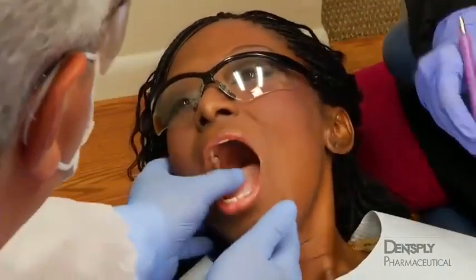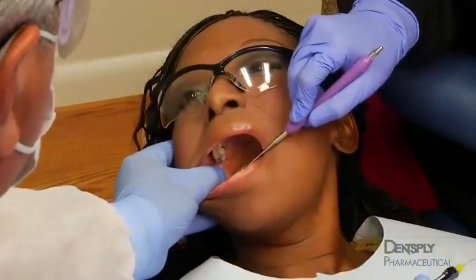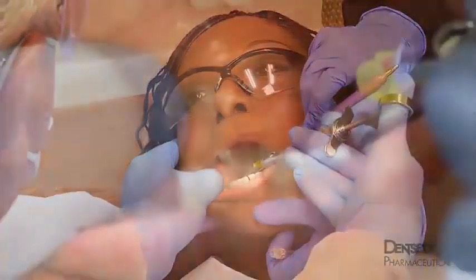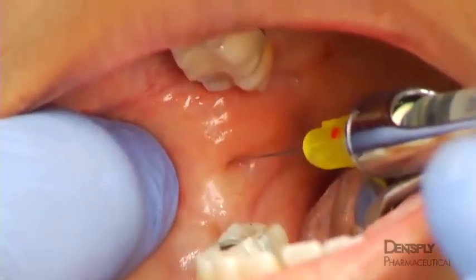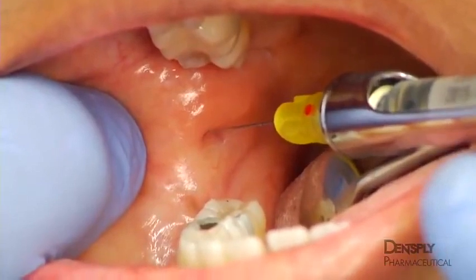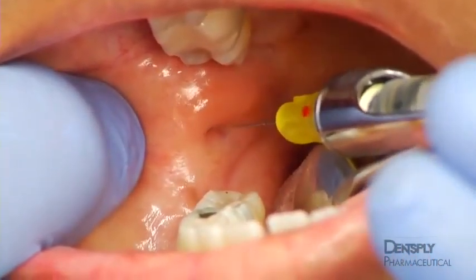Occasionally, modifications of the standard technique have to be made to achieve a successful injection. For example, during insertion, the needle may prematurely contact bone. This may occur when the patient has a narrow face, when the insertion point is more lateral than ideal, or when the barrel of the syringe is positioned too posteriorly over the contralateral teeth.